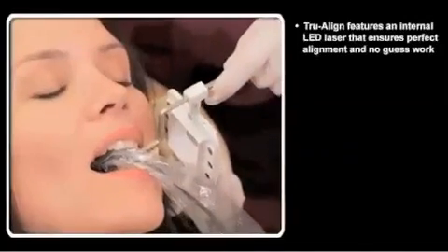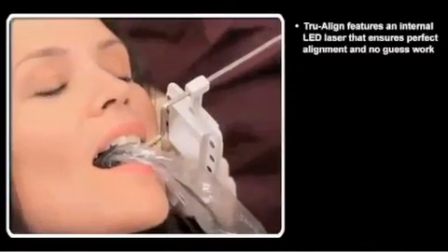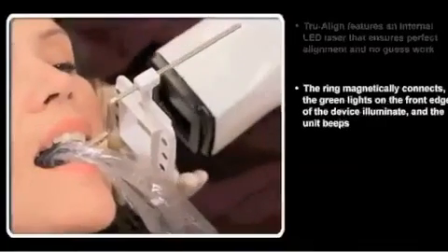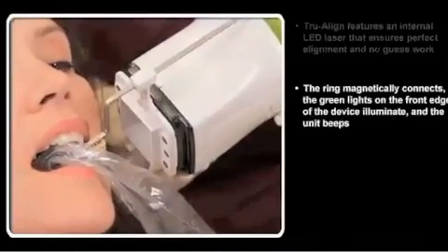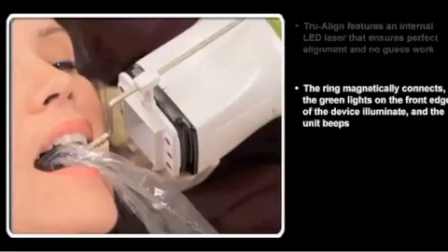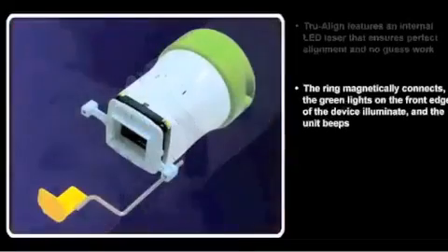When the laser and ring reflector are exactly aligned, the ring magnetically connects, the green lights on the front edge of the device illuminate, and the unit beeps, indicating a perfect image every time.